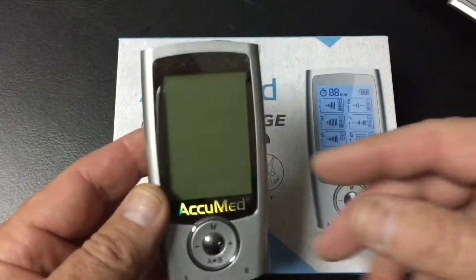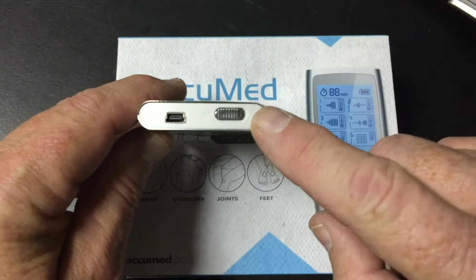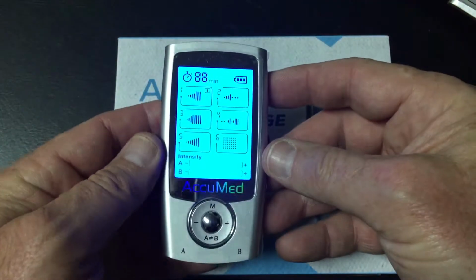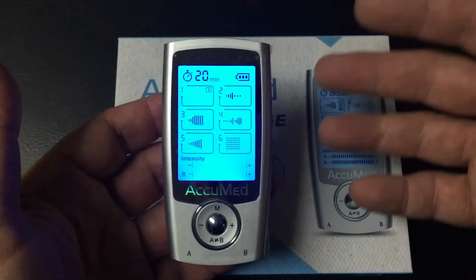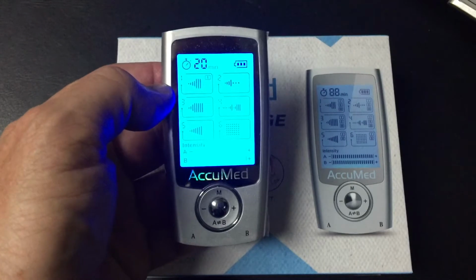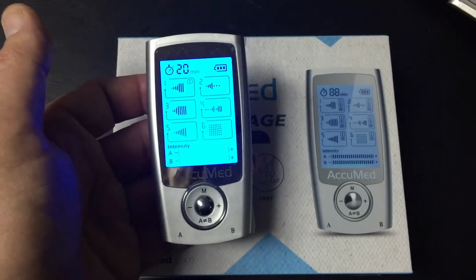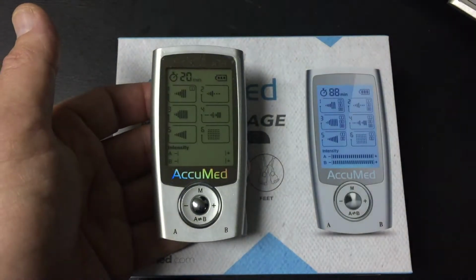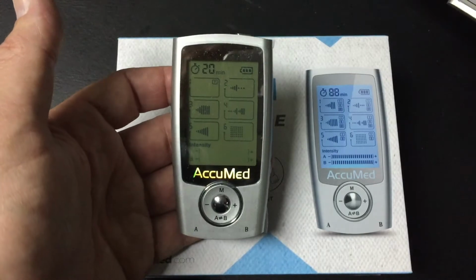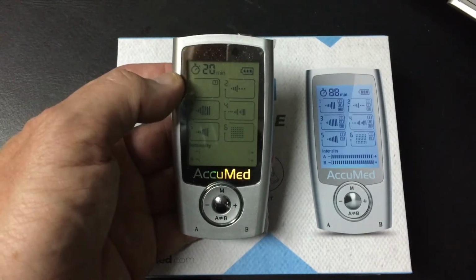Okay, let's go ahead and turn the device on. The power switch is on top beside your charging port. It's right here. When you turn this on, this is going to be kind of hard to see. I'm going to let the backlight go off, but it defaults to a 20-minute massage mode. You'll see it flashing here. Let's give this a moment. Okay, now it's off. Easier to see, but you'll see that it defaults to the massage mode, and that's the first mode here on the left side.